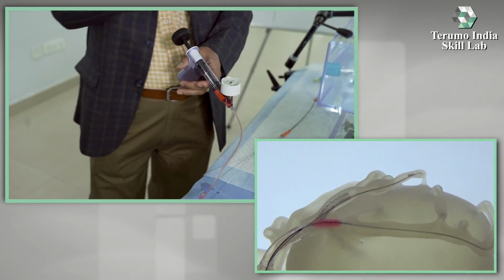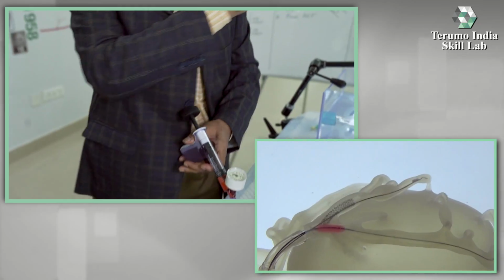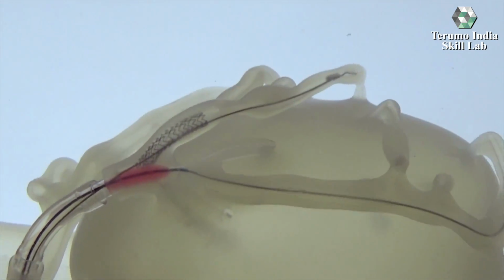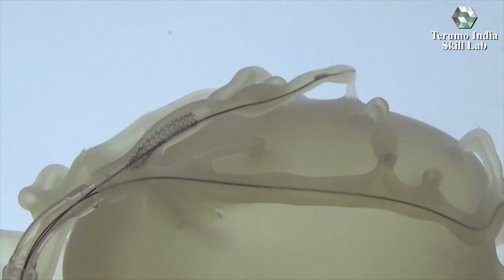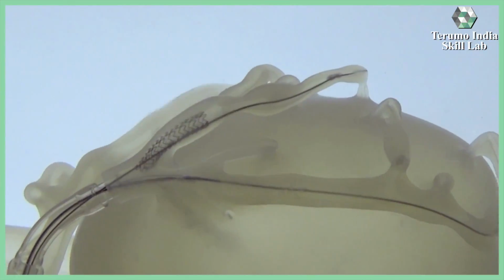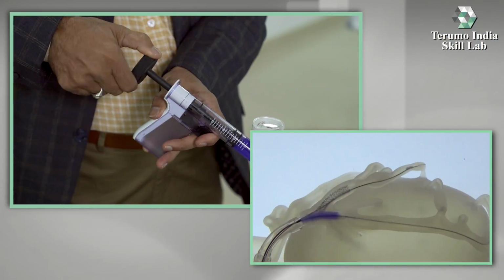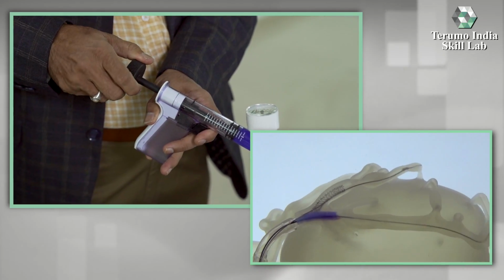So I think what we need is a larger balloon, because see, the crush is not enough. The crushed part should hit the roof of the vessel. Go up to 20.